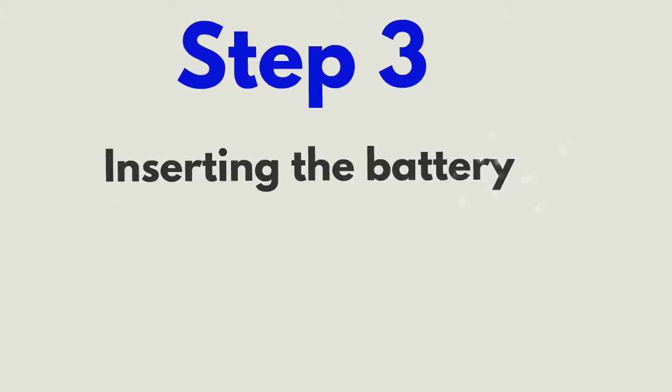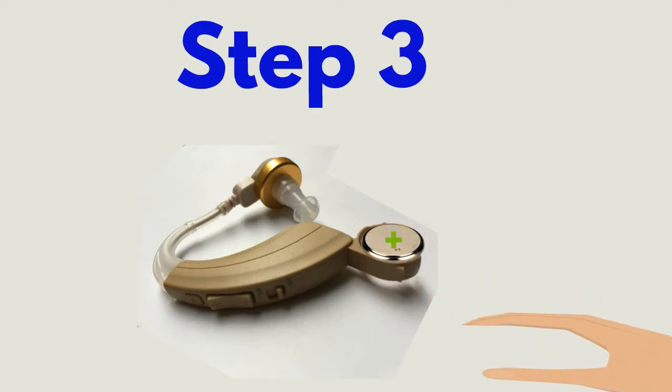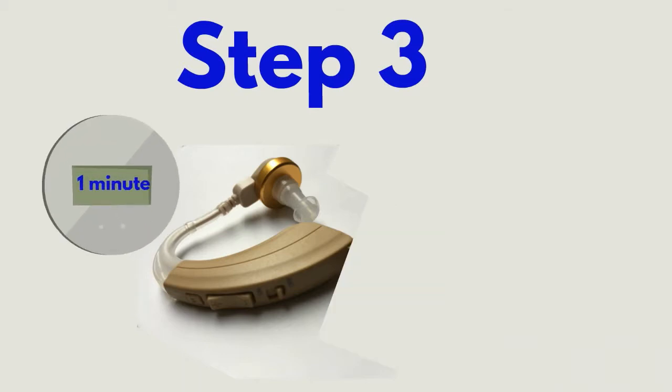Step 3: Inserting the battery. Open the battery door and ensure you place the battery on the tray with the plus sign facing up. Depending on the battery used, the tab on the battery must be peeled off. Wait one minute for the battery to activate with the air, as this will prolong battery life.